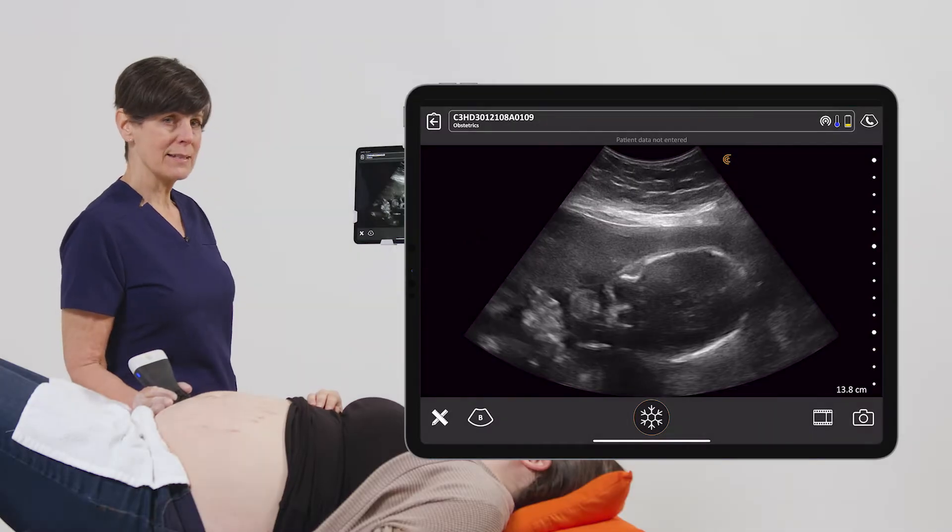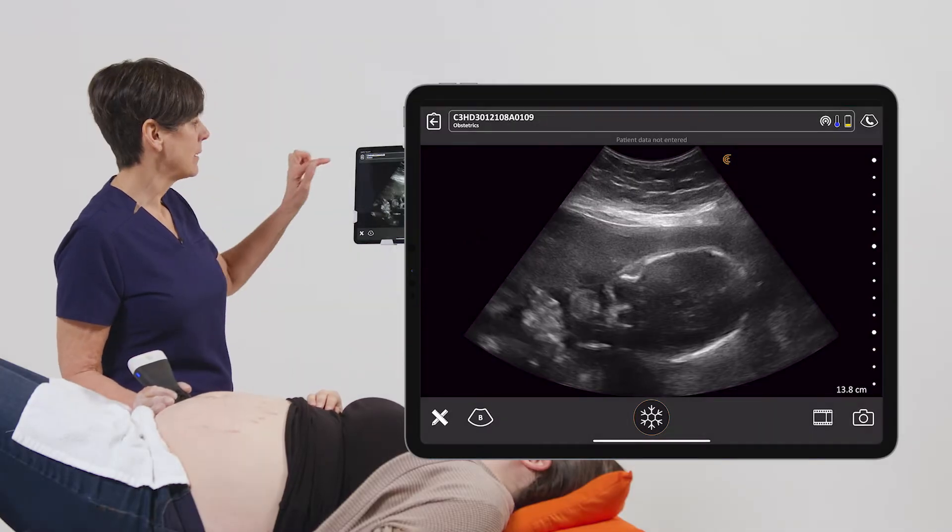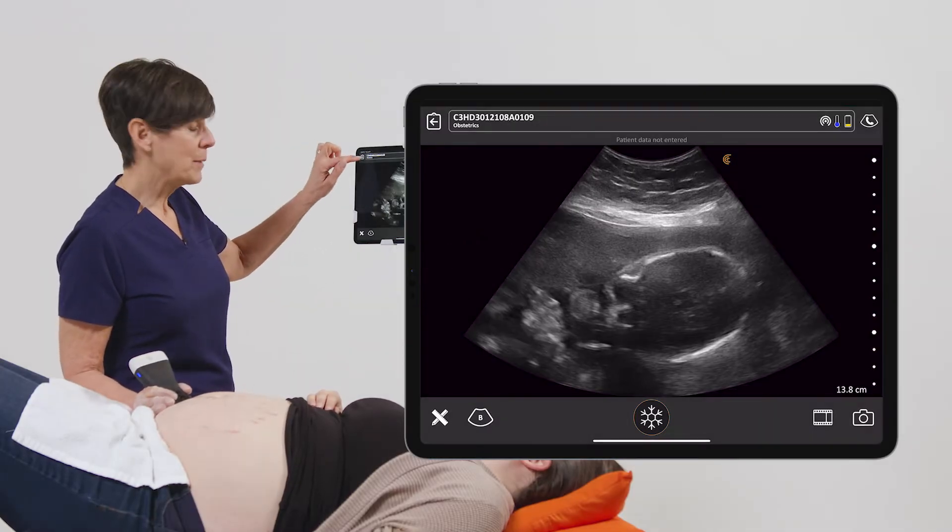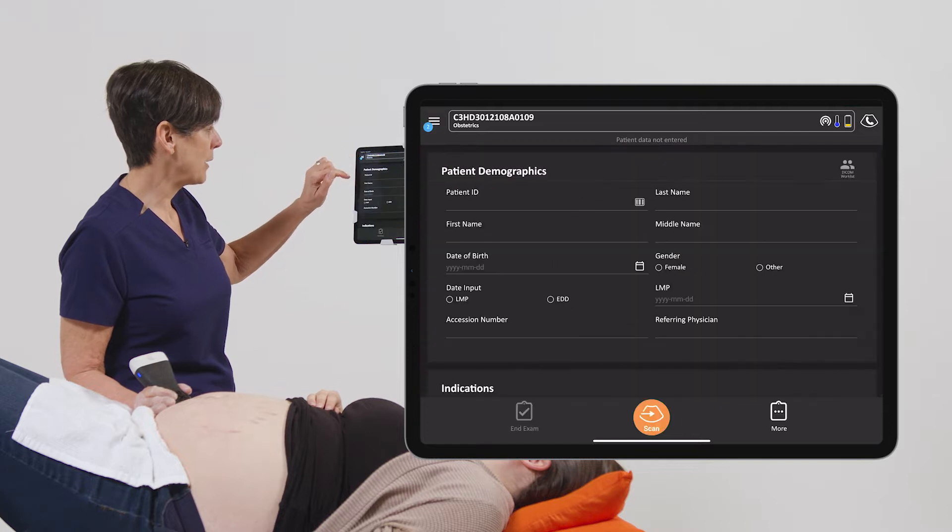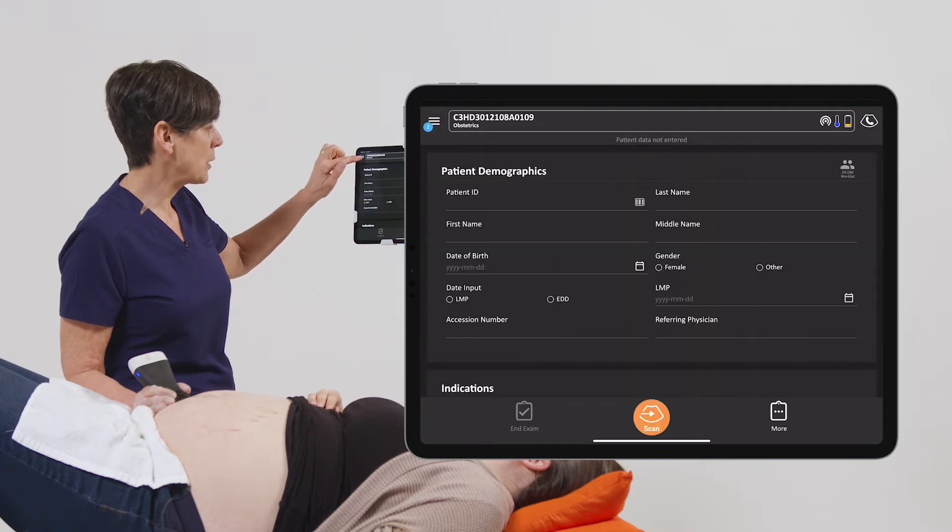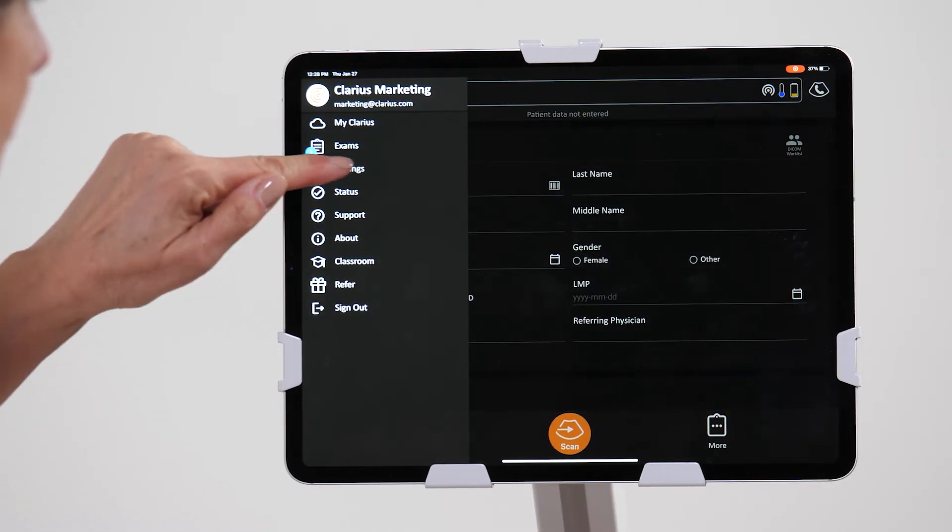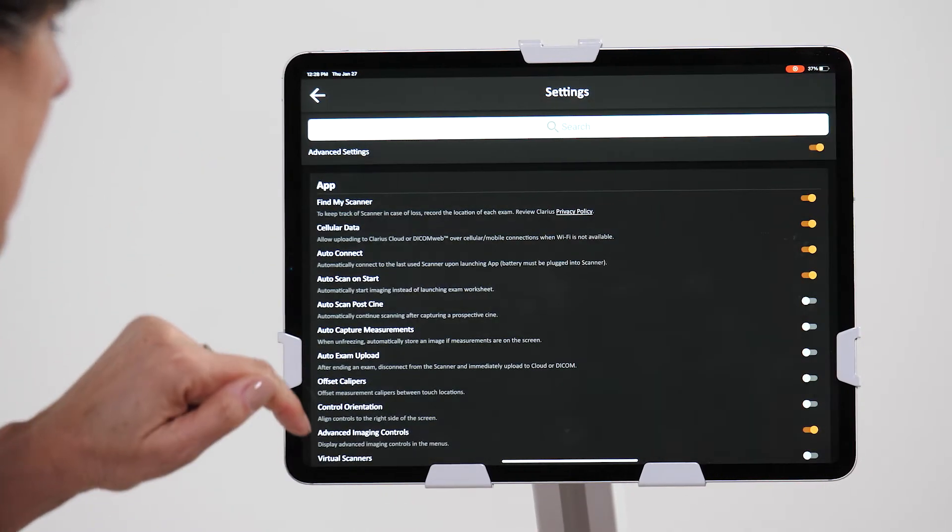To access the settings from the imaging page, we'll hit the back arrow and then go into the menu screen and into settings.